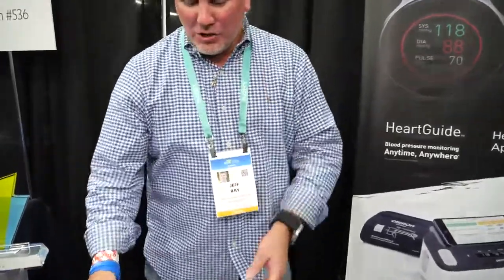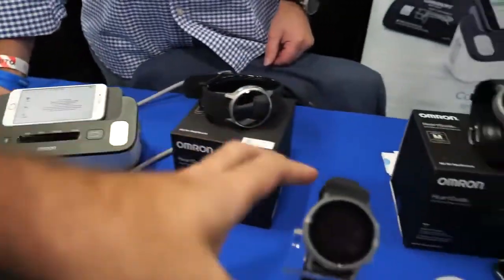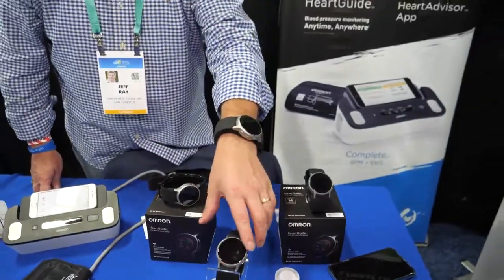The Omron Complete (with EKG) is priced at $199, while the HeartGuide wearable smartwatch is $499. The connected pill cap will be included as part of a premium package when purchasing either the HeartGuide or the Heart Advisor.